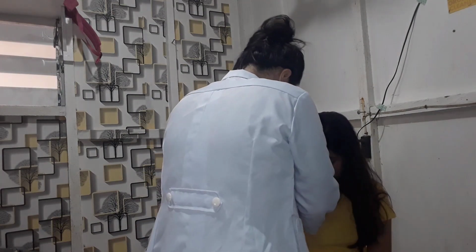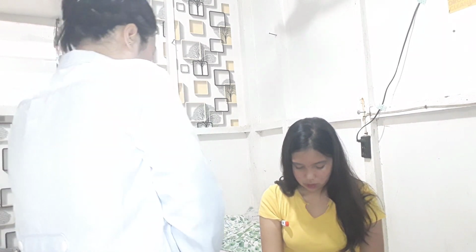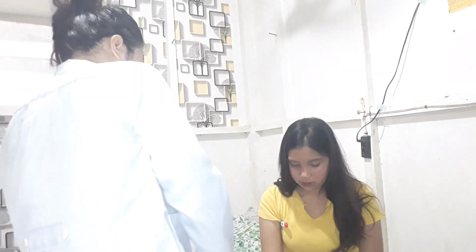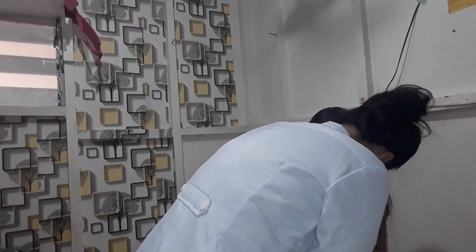Assessing the client's temperature. Assessing the client's respiration.